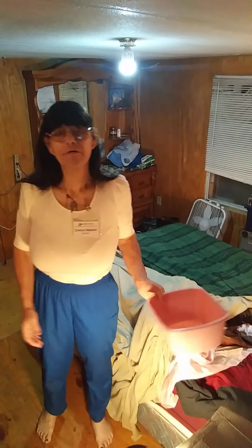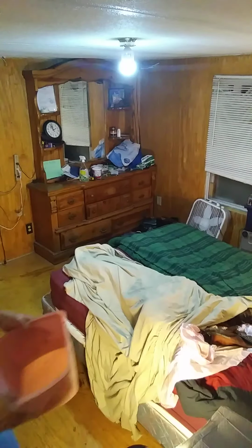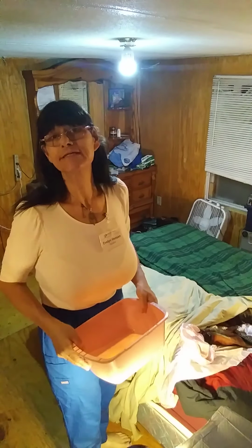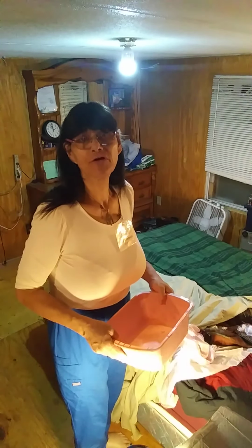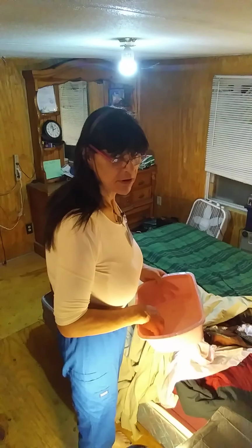I'm going to put some water in the basin. The water is warm to the touch. It's approximately 105 degrees. I'm going to check it to make sure it's not too hot or too cold.